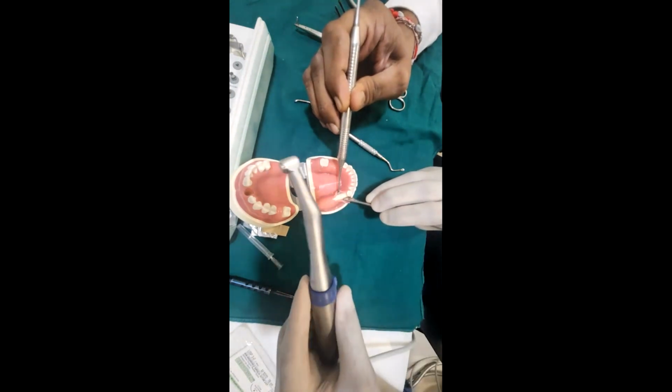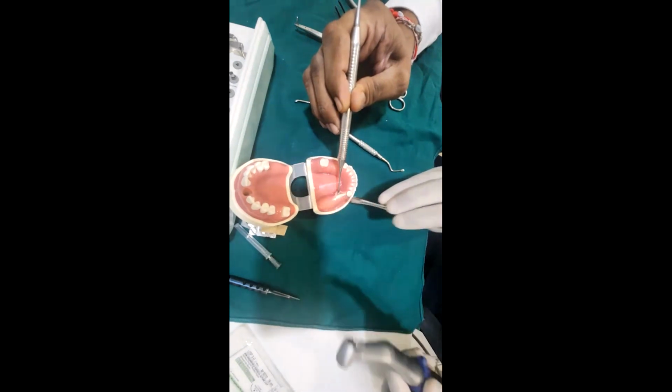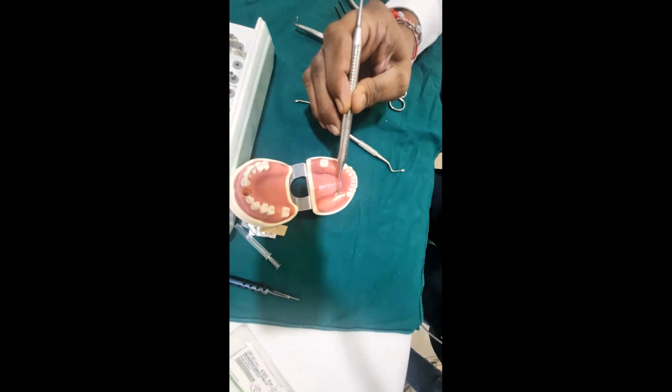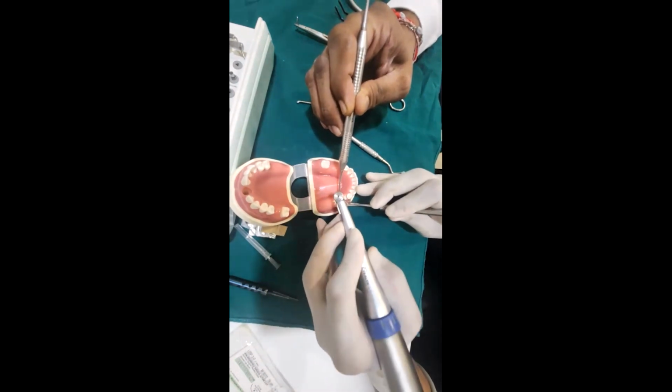This is our implant handpiece. You have the typical implant handpiece, 20:1 reduction. The speed on my handpiece is about 1000 RPM.